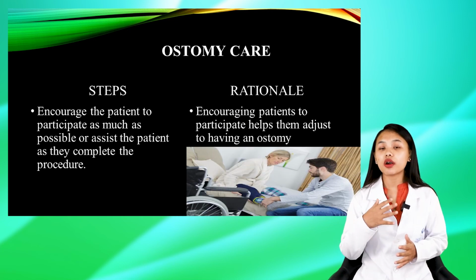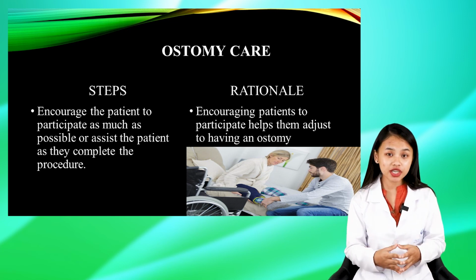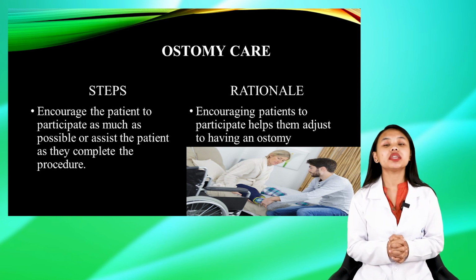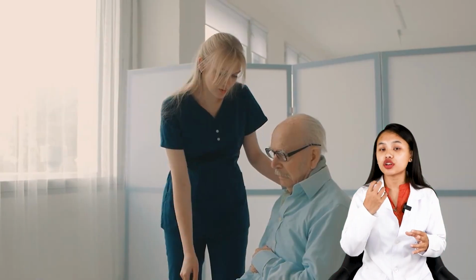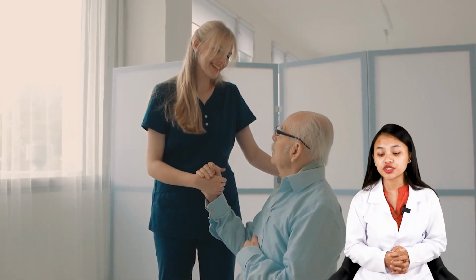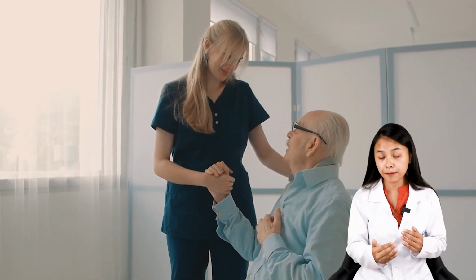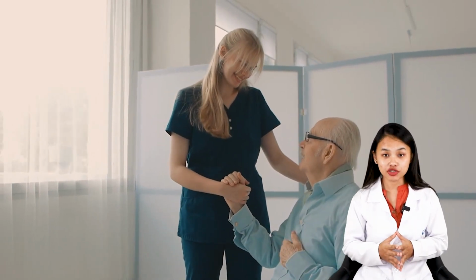You must encourage the patient to participate in the procedure as much as possible and also assist them in completing the procedure. By encouraging the patient to participate, it also helps them adjust to having an ostomy.